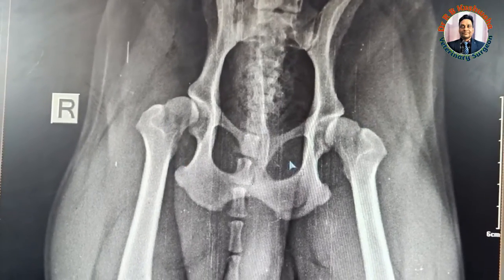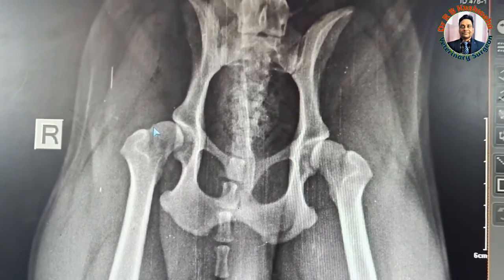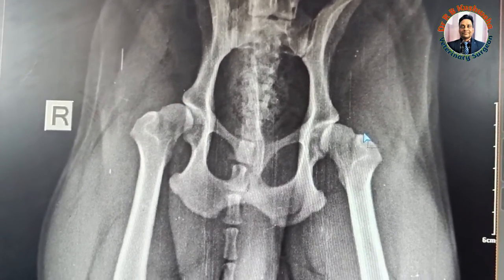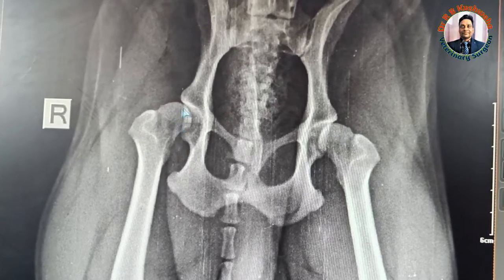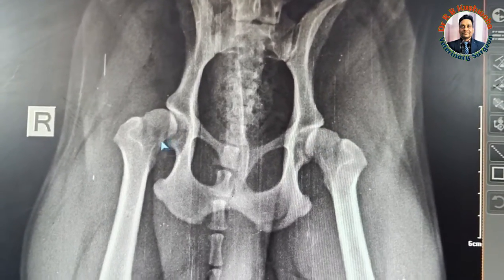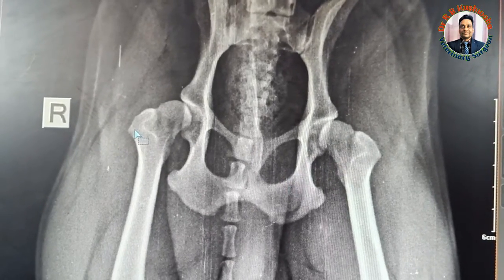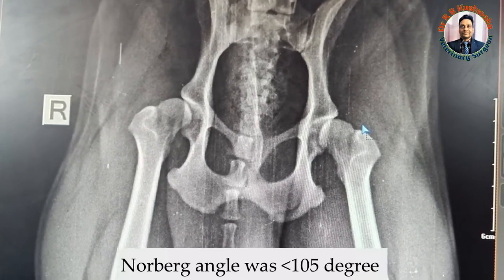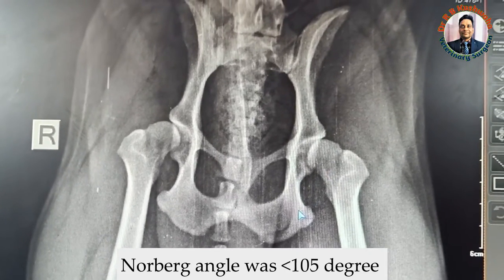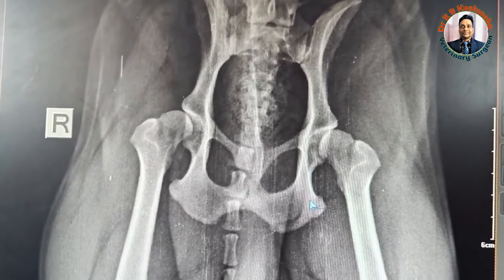As per the radiograph, this is a suspected case of hip dysplasia because the head is out of the acetabular cavity — some portion is inside and some portion is outside. We have also measured the Norberg angle, which is less than 105 degrees in this case, also indicative of hip dysplasia.